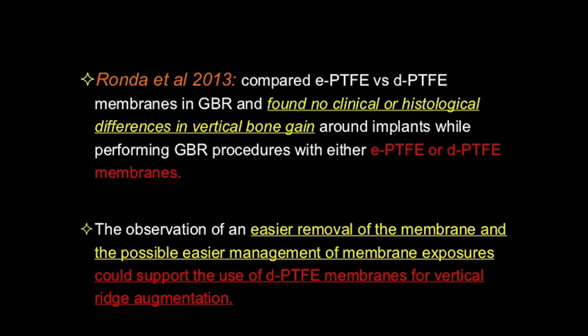The observation of an easier removal of membrane and the possible easier management of membrane exposure could support the use of the dPTFE membranes for vertical ridge augmentation in comparison with the ePTFE. So the dPTFE showed to be better and easier in removal and had less membrane exposure.